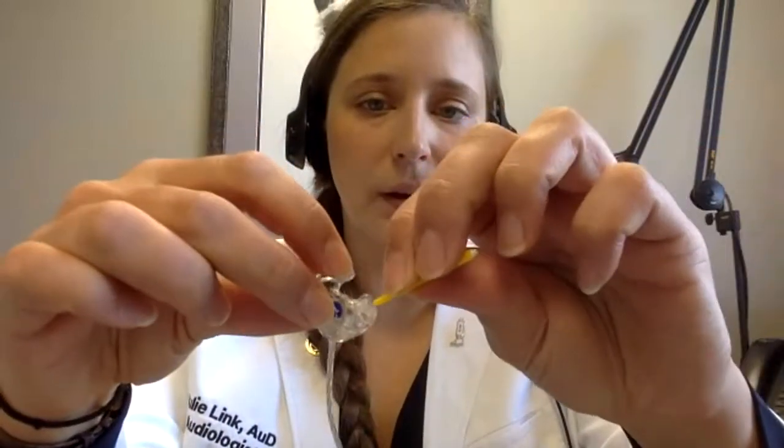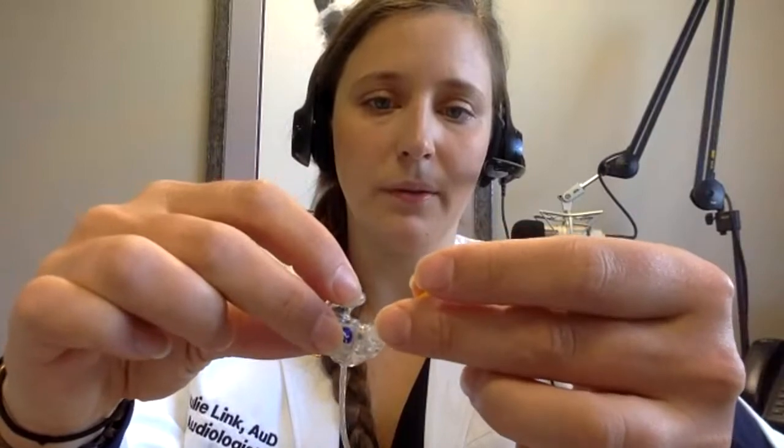Okay, so let's move on to in-ear monitors real quick and earplugs. So, where's that other earplug? Okay. Like I said before, I've got these in-ear monitors for running, so they're wired a little bit differently. Mine actually have that port for a wax filter, so that's a pretty quick and easy way to clean my monitors if they were to stop working. Usually it's going to be that wax filter again. So we're going to grab that filter out here and then put the new one in through here. Same thing as those hearing aids.